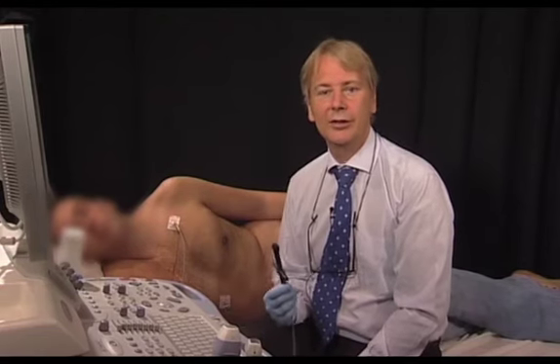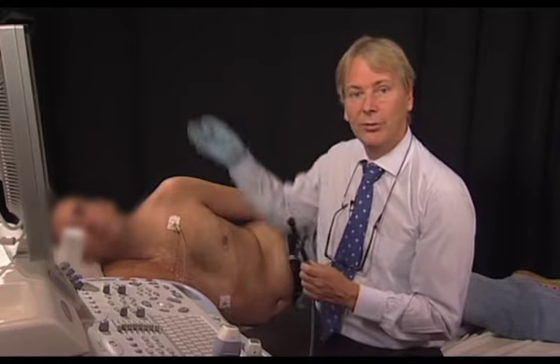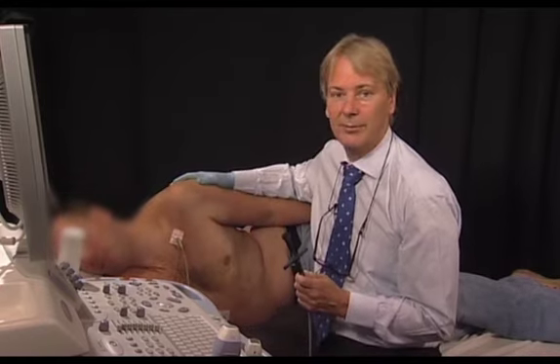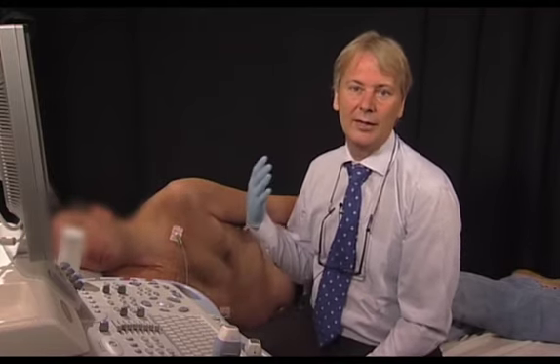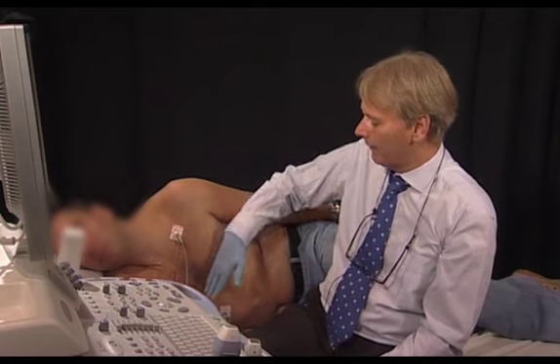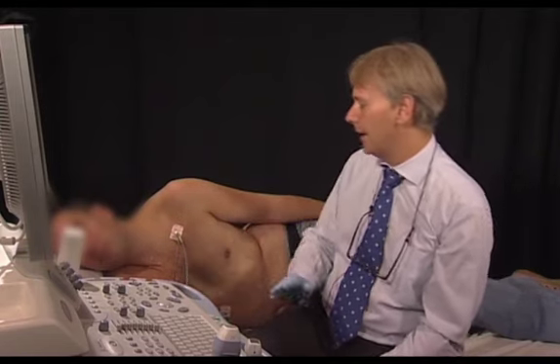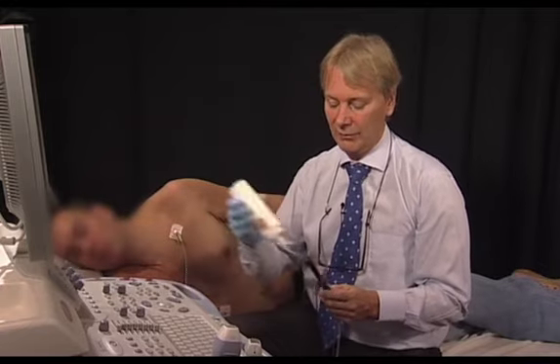To quantify aortic stenosis from a right parasternal approach, we also need the pencil probe. It is also important to position the patient in a position where he's turned as far as possible towards the right. And then we have to remember what the anatomy of the heart is and where we can actually expect the jet to go. So the heart is here on the left side, and the jet can go in many directions. It can go fairly flat, but it can also go fairly steep towards the head. So we have to try more positions and more windows and try to see where we get the optimal signal and the maximal velocity.